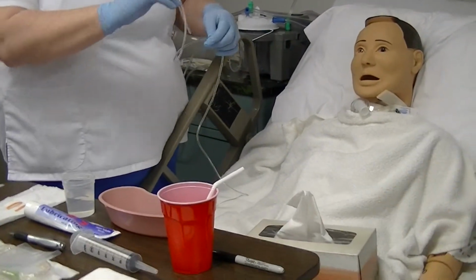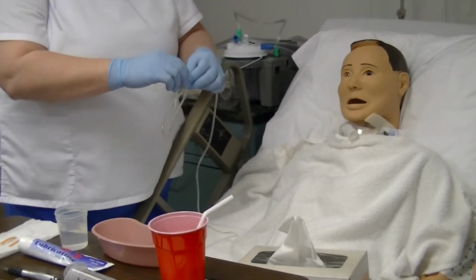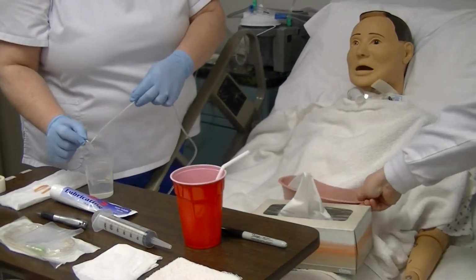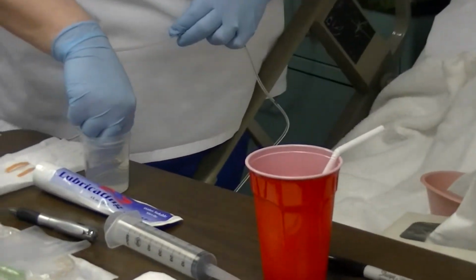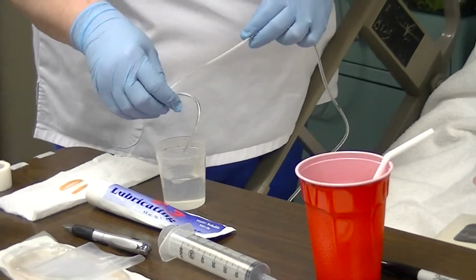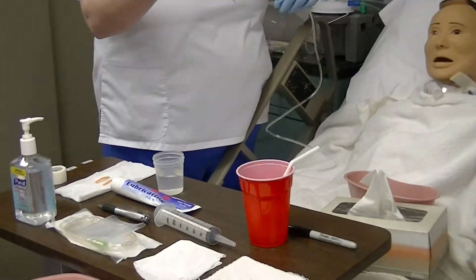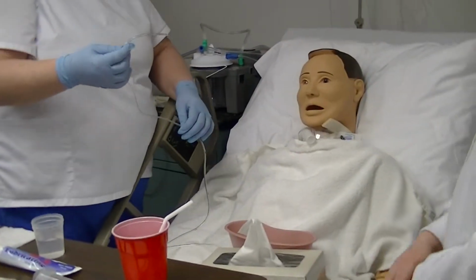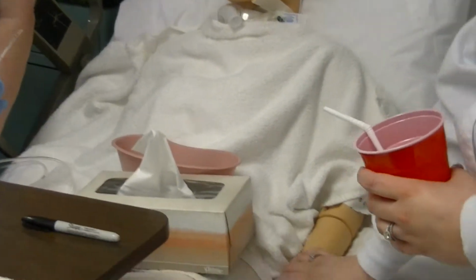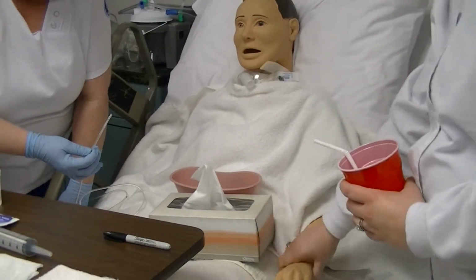All right. While maintaining clean aseptic technique, you're going to lubricate the tube 3 to 4 inches from the end with water-soluble lubricant. And for these purposes, we are going to use plain water because our mannequins do not do well with the lubricant. You're going to instruct the patient to give a signal that he may need to pause. If you have any trouble, just raise your hand and we'll stop.